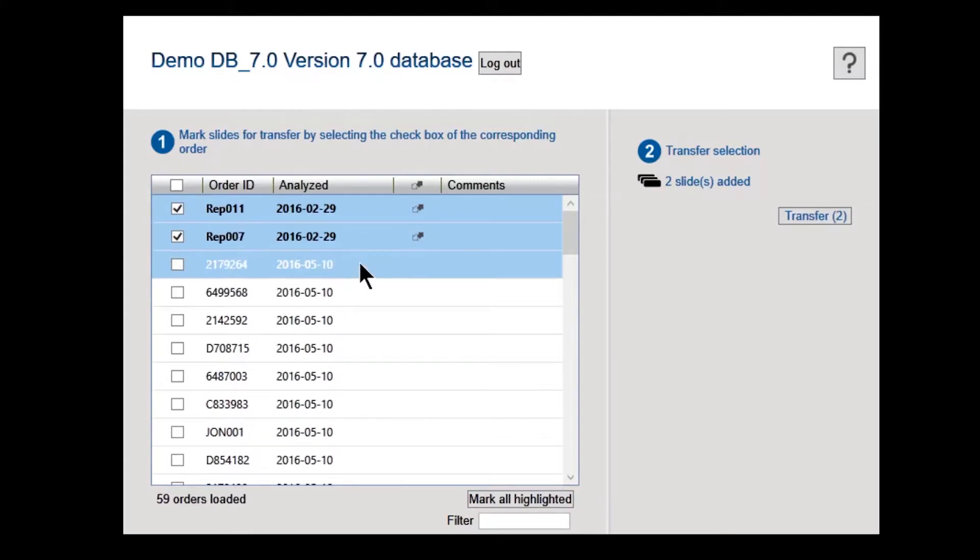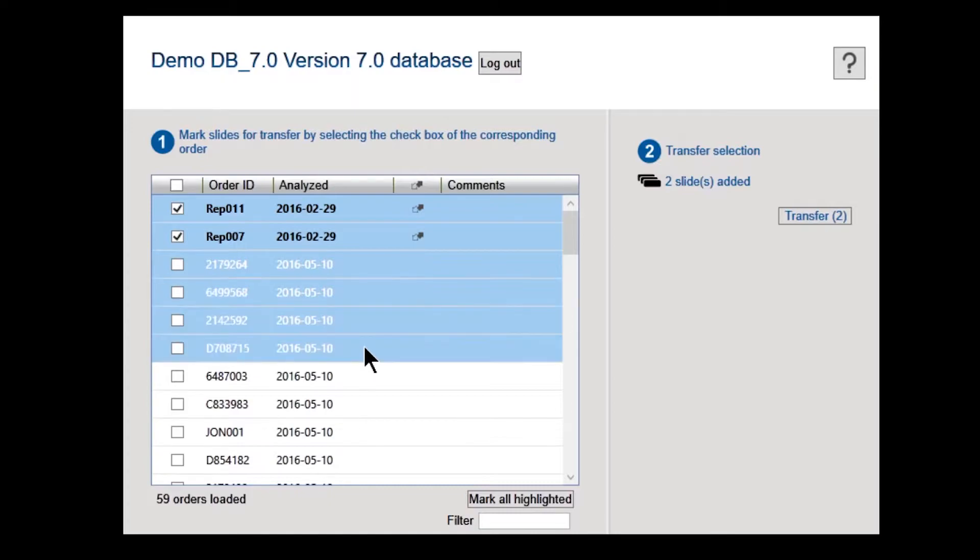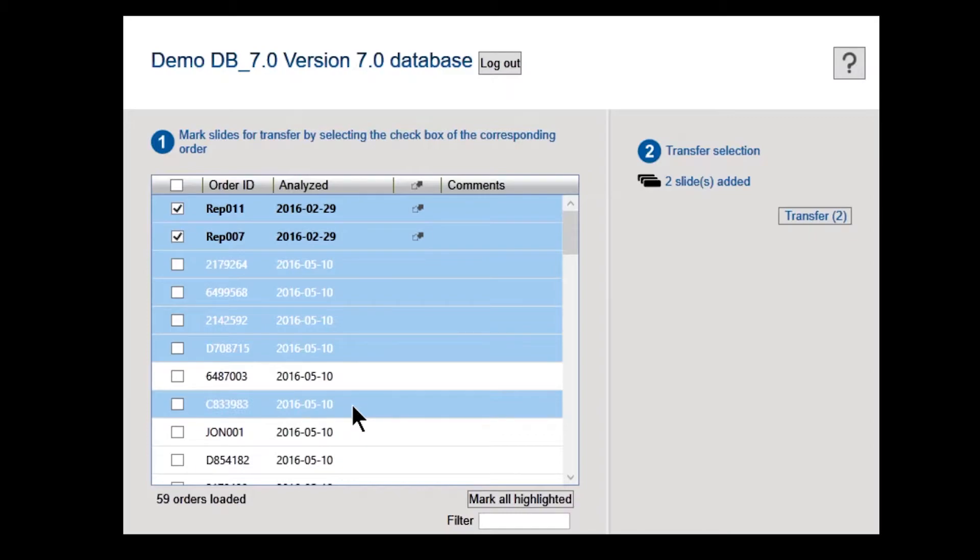Select individual slides by clicking them. You can also select multiple slides at once by holding down Shift or Ctrl while clicking rows. Should you want to transfer all slides within that database, you can click the checkbox in the column header.